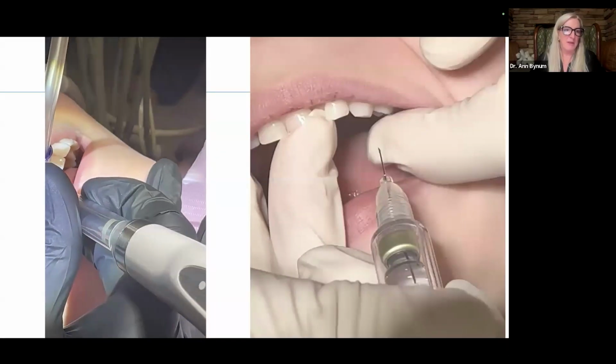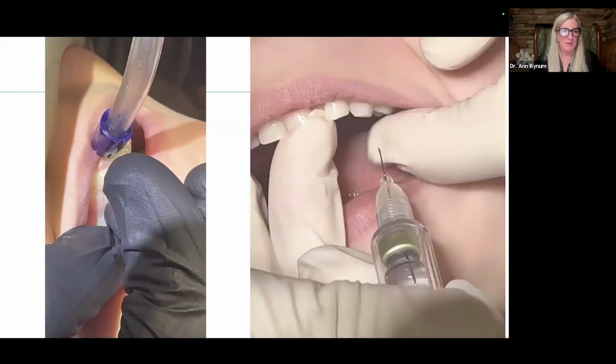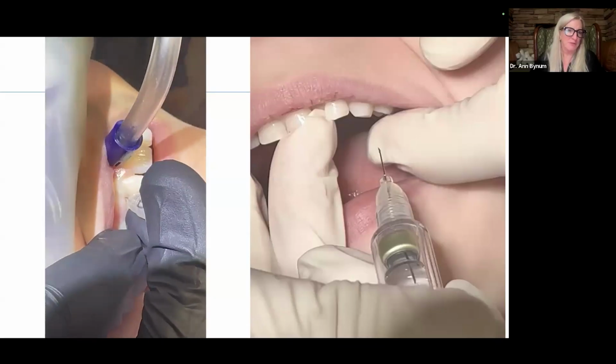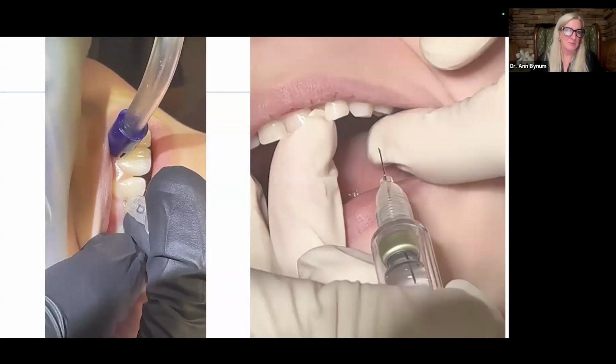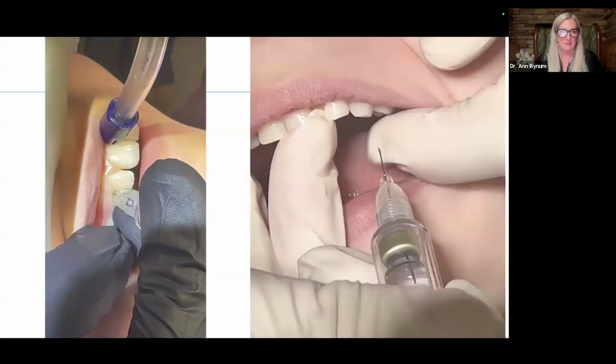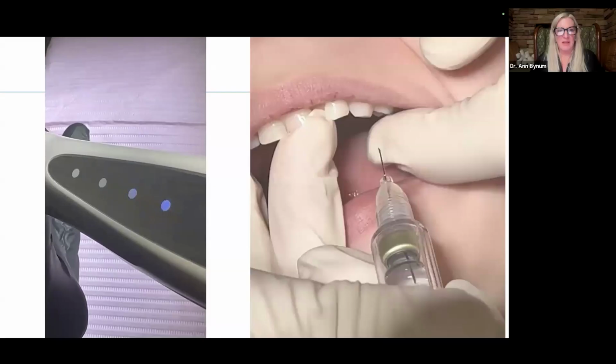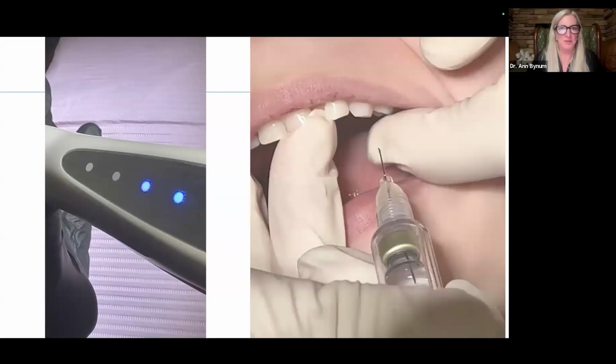So we're going in, we're making positive connection with bone, then we're giving it a little twist. That's a pro tip for you right there. Give it a little twist, helps it get in there, and then a little tug back to make sure it's in. Just showing you the lights right here, the blinking lights. It's telling you how much pressure the device is experiencing at that moment.